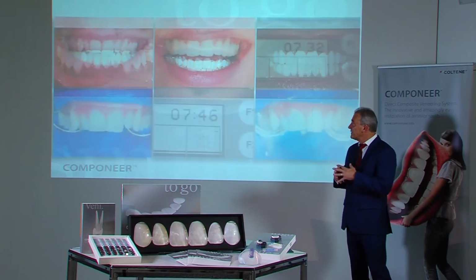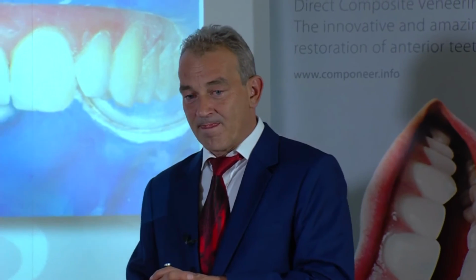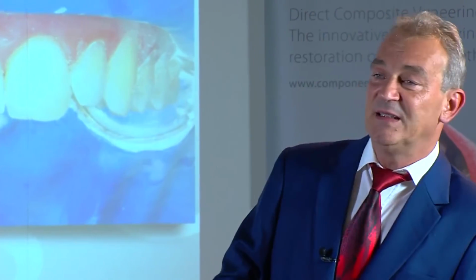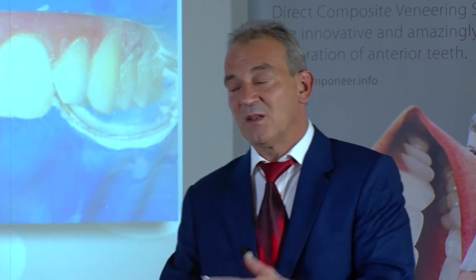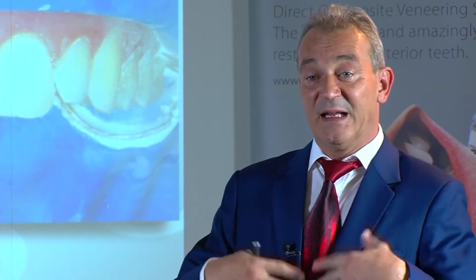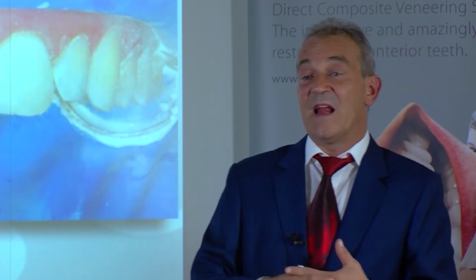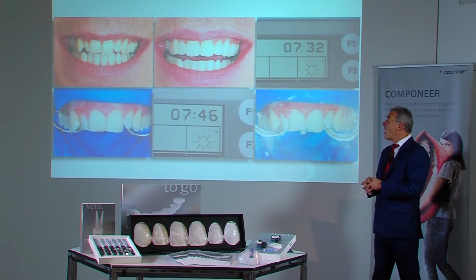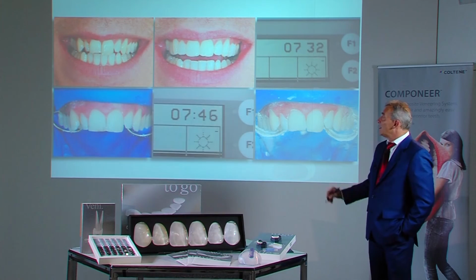This all sounds relatively easy, and it is easy. The componeer system is extremely efficient for dealing with normal cases like these. And in difficult cases, componeer is a very good aid. Under normal circumstances, the system offers a time-efficient procedure which is attractive time-wise for the patient and the dentist alike. This is why we see the clocks superimposed.